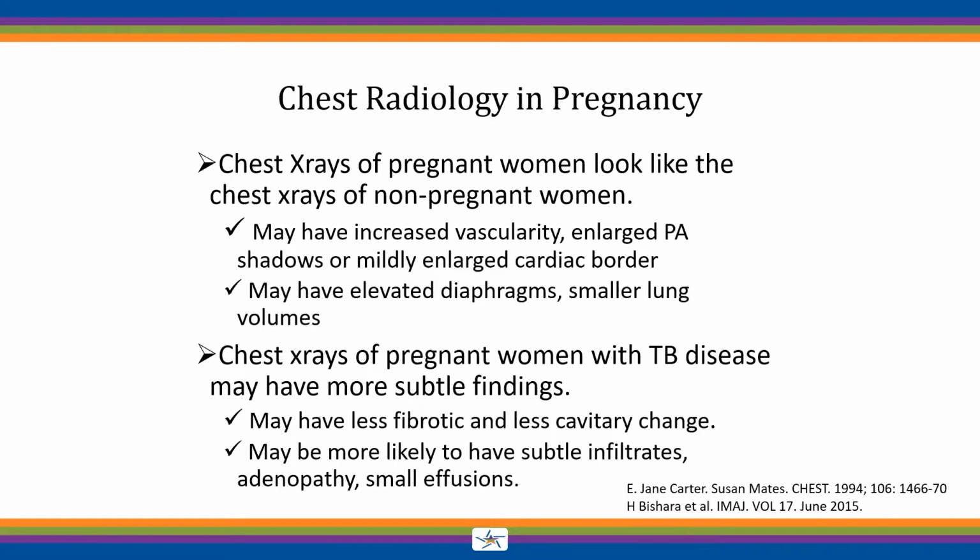And we have all kinds of different terms for them, those of us that look at films all the time. Dr. Armitage likes to call them nib-knobs. I call them ditzels. But if there's any question at all, I encourage you to ask someone else to look at it, or to go back to the patient and just think harder. Little things in pregnant women may be something important.